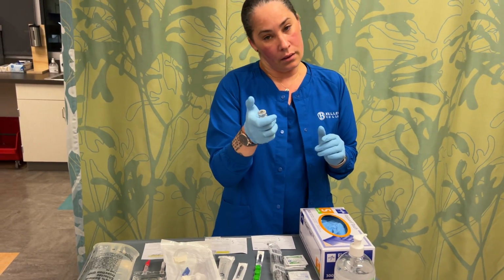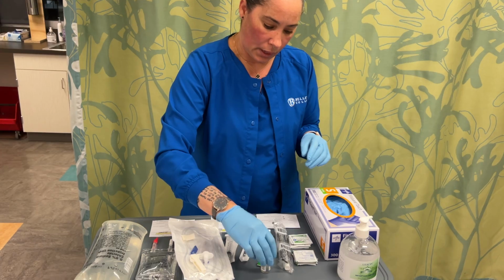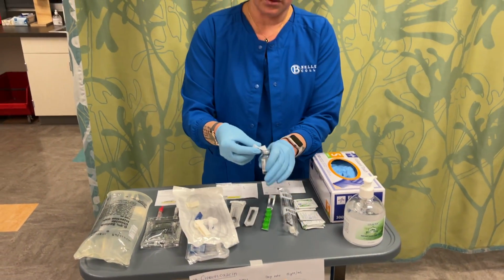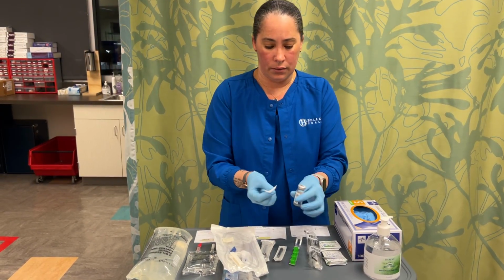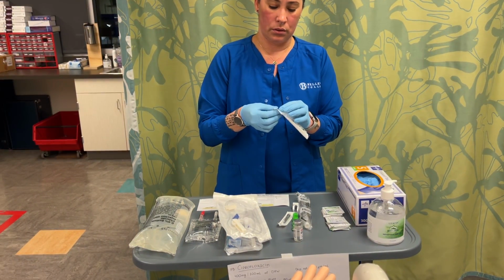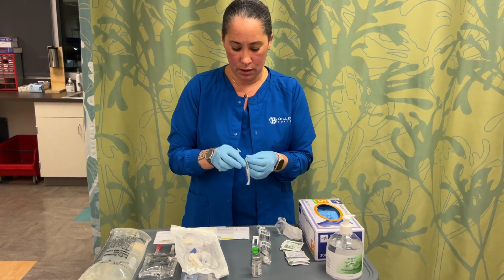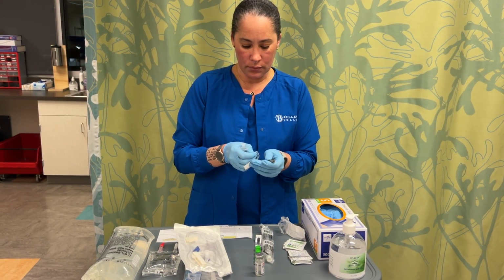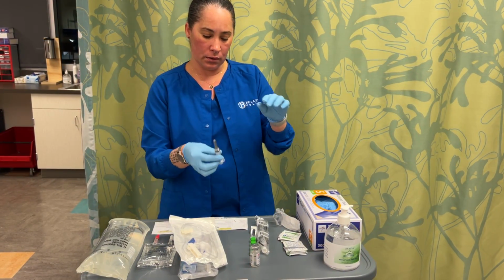So the cap fell off because this has been used, but you're going to pop the cap and you are going to clean the top. You're going to want to clean this for 15 seconds and let it dry for 5. So while that's drying, we are going to open this up and put our blunt needle on. This is ready. All right, so here's our needle.